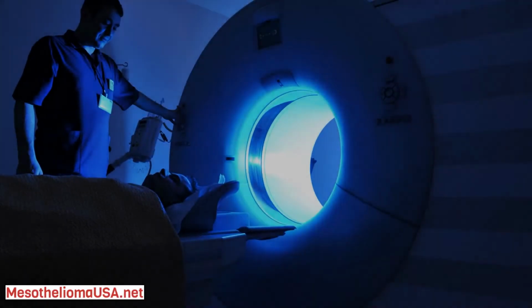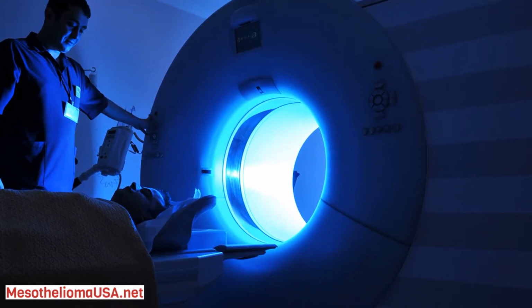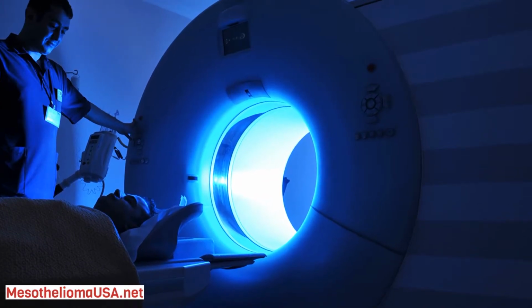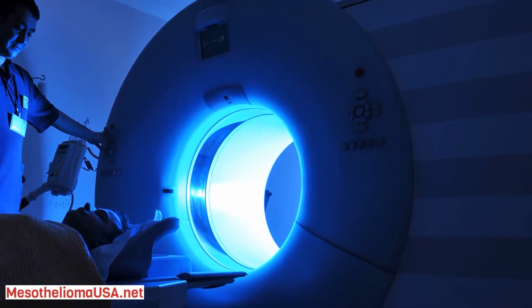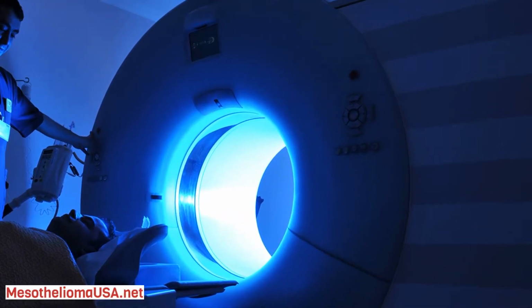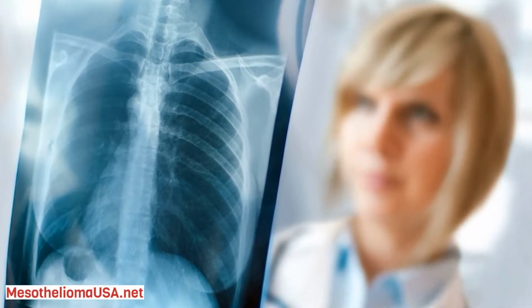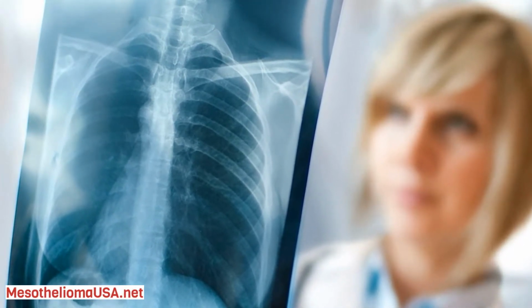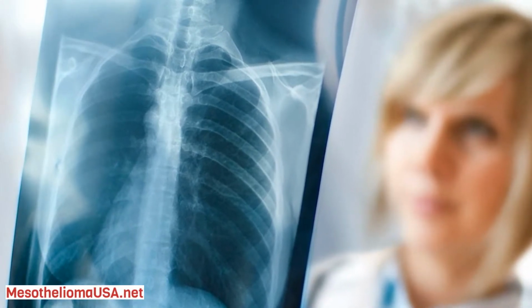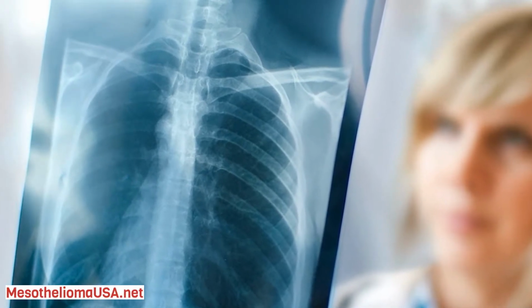A checklist of relevant findings was fulfilled for each case, and the most probable diagnosis according to CT scan was made by the radiologist. Studied CT features consisted of pleural and pericardial effusion, pleural and pericardial thickening, parenchymal infiltration, fibrotic band, subpleural nodule, contralateral extension, contraction of involved hemithorax, pleural mediastinal shift, lymphadenopathy, thickening of the interlobar fissure, diaphragmatic involvement, and chest wall/hepatic/intraperitoneal invasion.